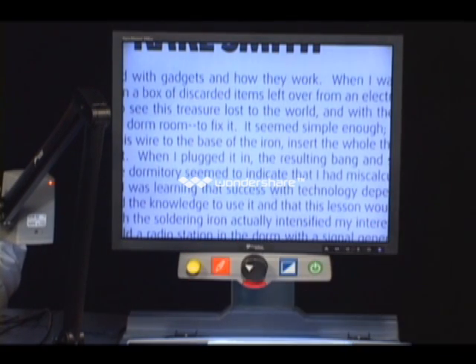This, again, helps the low vision person to determine. Some people may like it one way, and you may look at it and think, good heavens, how do you read that? And to them, it's beautiful, because they just want that. They just want a little bit of brightness, but not too much. Certain eye conditions, lighting is just awful. Lighting can be your enemy in that, too. So put that back where you would normally think it would go. He has his preferred place to put it.